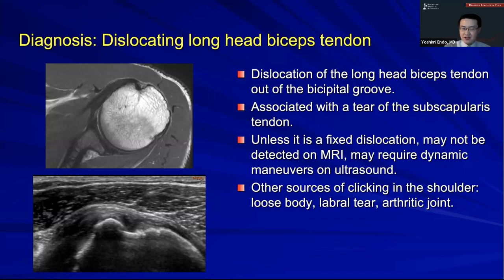If you palpate, you get a sense of what kind of structure it is. Is it a tubular structure or a focal mass? How big or small is it? Is it pea-sized, or the size of an orange? I think examining the patient and getting a sense of what you're dealing with is always helpful before you start scanning.